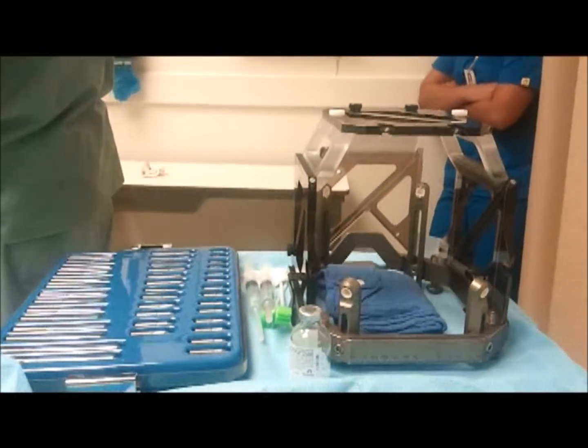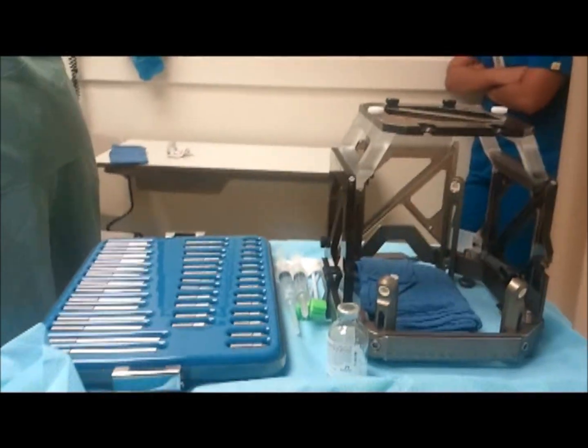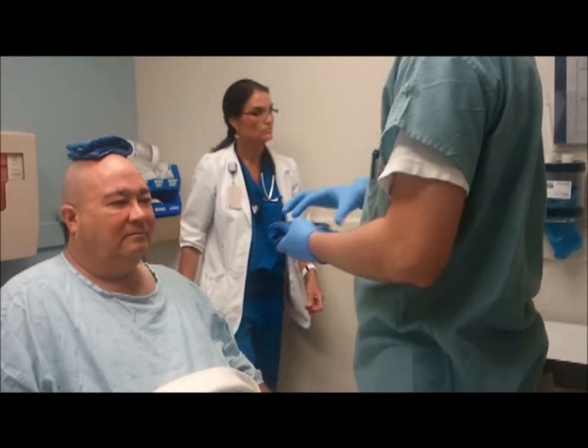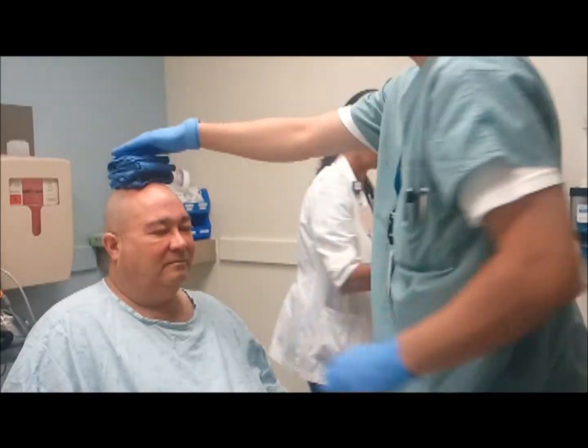So here's what we're going to do first. I'm just going to place these balls on the top of your head and I'm going to ask you to hold the frame for us. I'm just going to start doing some measurements here first.